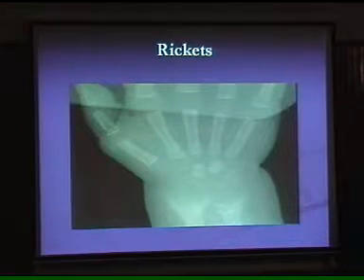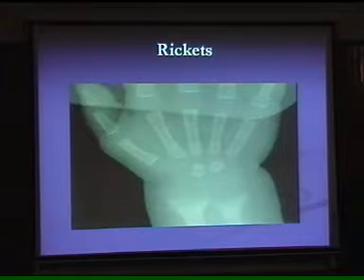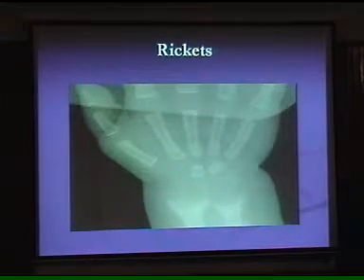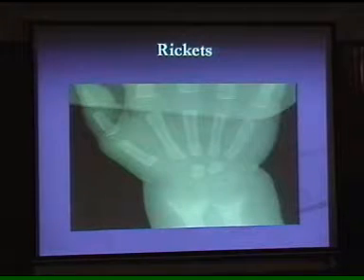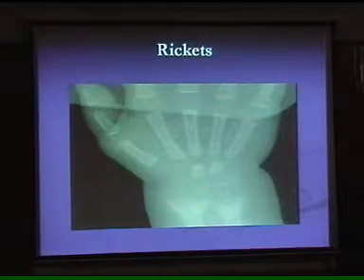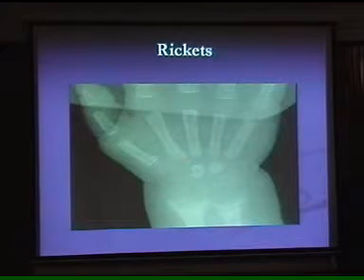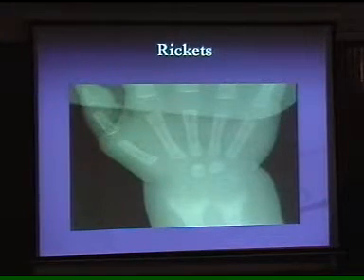Second thing is, once you are doing the X-ray of the chest, a very important sign is in newborns or small children. X-ray chest does not mean only lungs and the heart. Please, X-ray chest means the entire area of that skeleton, and X-ray chest means the upper end of the humerus. X-ray chest means the diaphragm. So once you're looking at the X-ray chest, please look at this upper end of the humeri, because that is the other area where you'll find these typical classical signs of rickets, which I'll show you in this next X-ray.